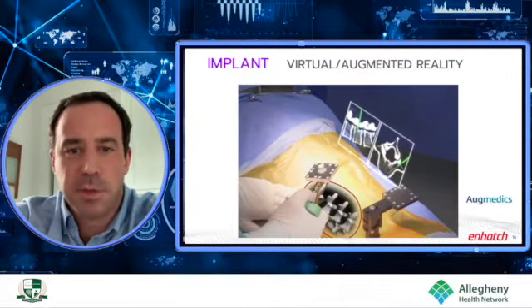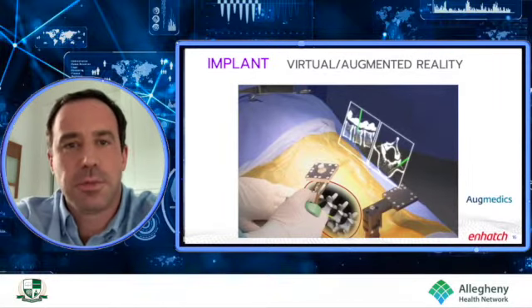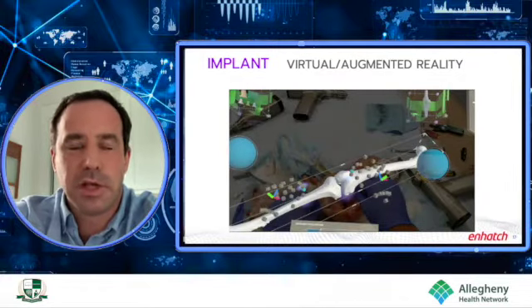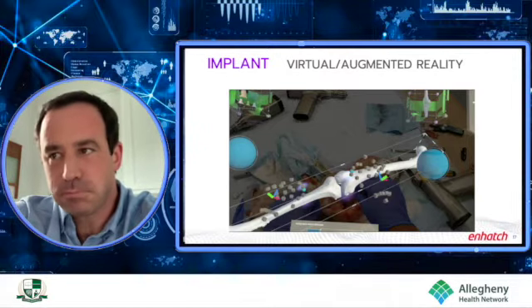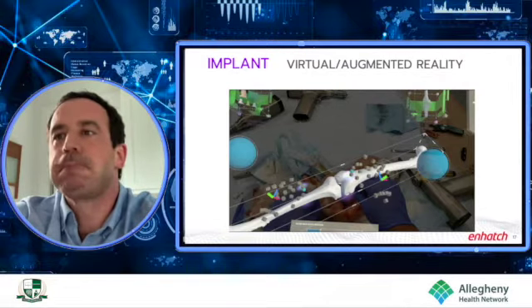Augmented reality is becoming increasingly present in the space in spine surgery and in arthroplasty. You're seeing the first few generations of these type of systems that really correlate that three-dimensional modeling, three-dimensional imaging to what the surgeon is seeing in the operating room, and just giving more information in a heads-up display format that can be integrated into the surgery. Again, aimed at more accuracy. Three-dimensional representation of that in this slide.